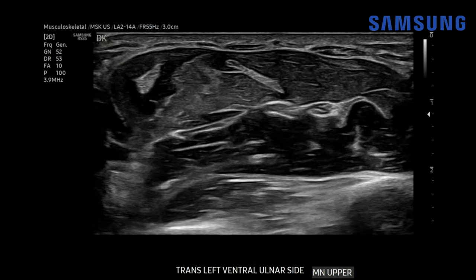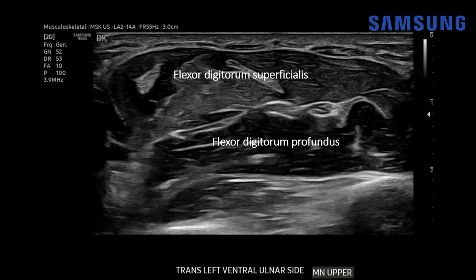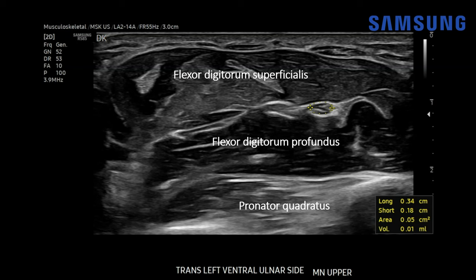If we move a bit more proximally in the wrist, still on the ventral aspect, we can see some muscles. This is the flexor digitorum superficialis muscle; deep to that is the flexor digitorum profundus muscle, and below that is the pronator quadratus muscle — a good landmark because it'll be located transversely between the radius and ulna. The median nerve is located in between these two muscles at this level, and here we have a normal area of the nerve measuring about five millimeters squared.